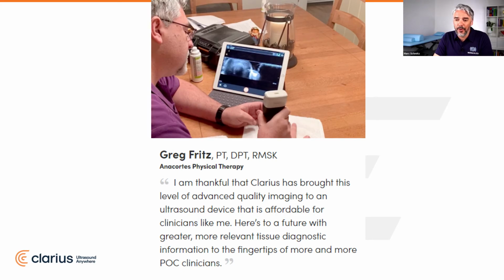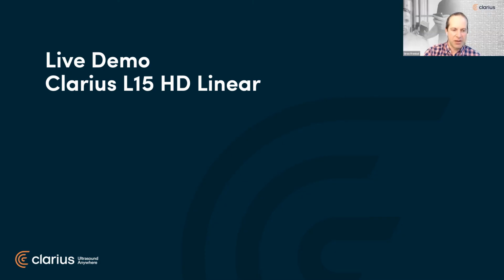So I told you something about the Mediterranean way and the Anglo-Saxon way of scanning. The reason why I stand behind the patient is so that the patient has the ability to look at the screen as well, and to make it a sort of education, to motivate the patient to do his exercises and to understand what the exact problem actually is. That's really great.